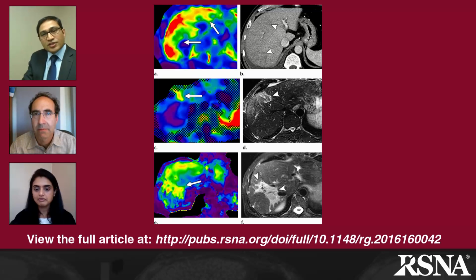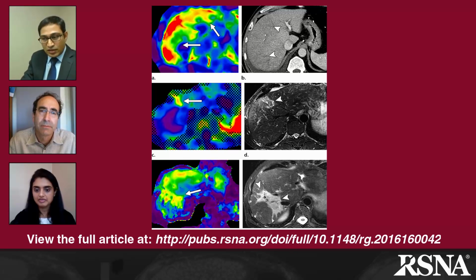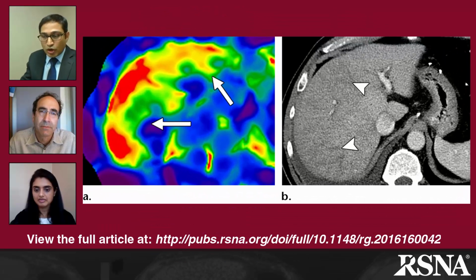It's very interesting. Initially we didn't think that this distribution of stiffness had something to do with the heterogeneity of fibrosis and may not be very important, but as we increased our experience, we started noticing that particular diseases or particular conditions do have a characteristic stiffness pattern. For example, if you look at figure 15, the first image, the top row images.